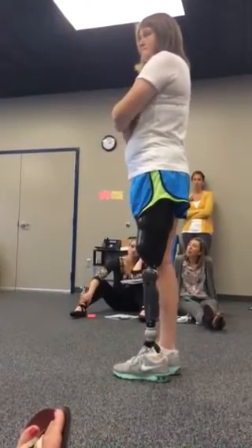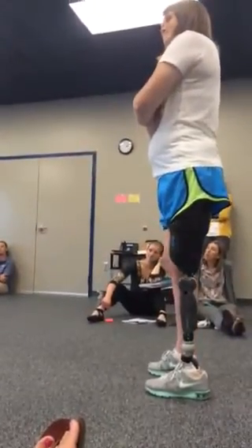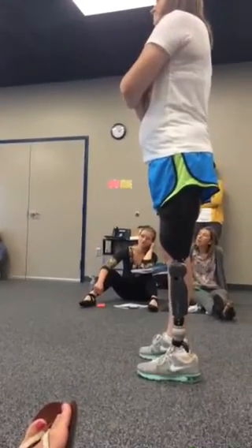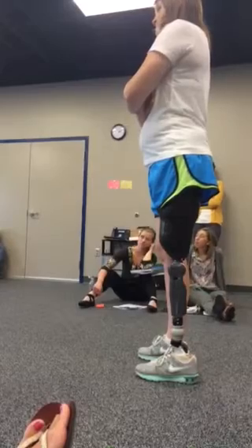And if you have carpet, you can actually put the adhesive hook on the heels, and then they walk and it goes, and you can hear them, and then they can hear that they're doing a quick step, like that, and it kind of gives them some auditory feedback.